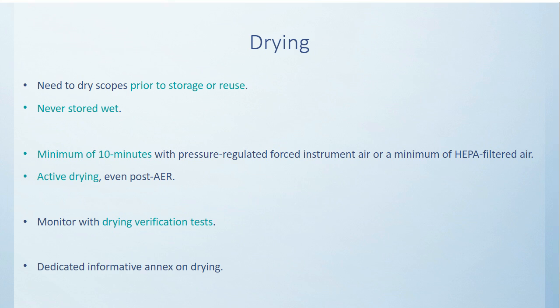So following manual or AER cycles, we follow with active air drying. Remember, the cycle in an AER is only a purge of air. The guidance here is a minimum of 10 minutes with pressure regulated, forced instrument air or a minimum of HEPA filtered air.